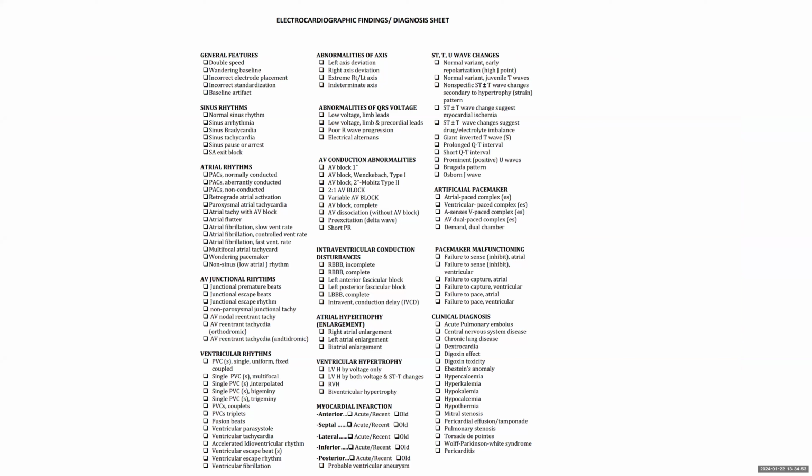Okay, can we code STT changes while we code STEMI? Yeah, again, these codes are really an exam thing. It's not real life. So I think if it's correct, no one will fault you. I don't do exam questions, so I don't know the details of how they assign points. But from the ECG point of view, this code is correct.